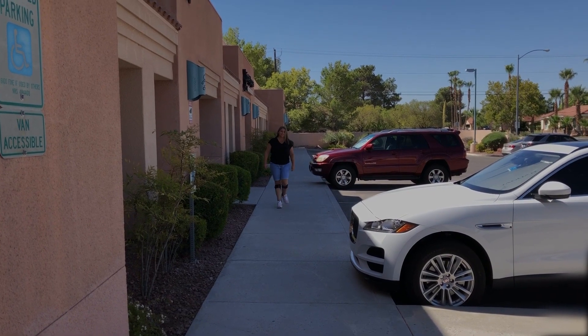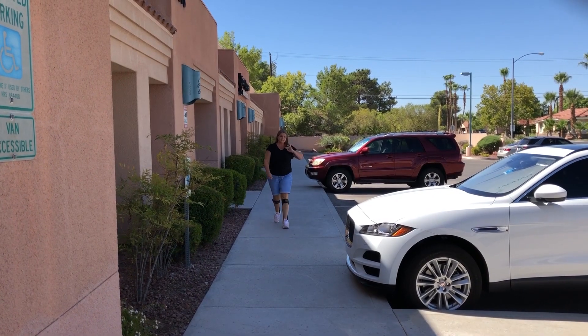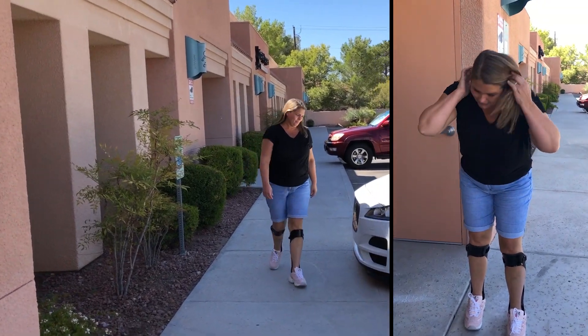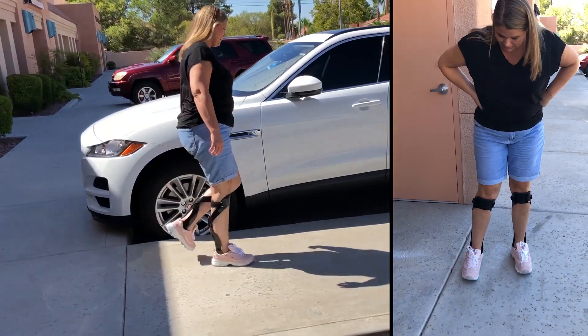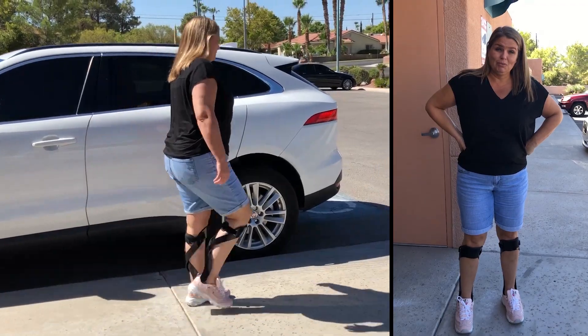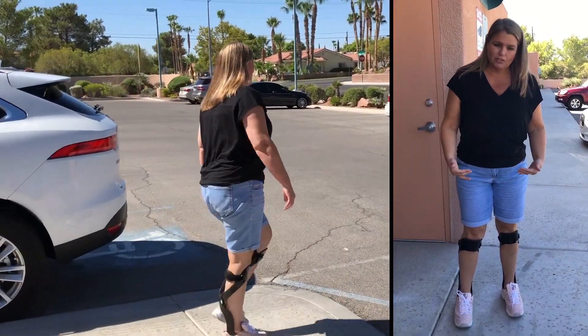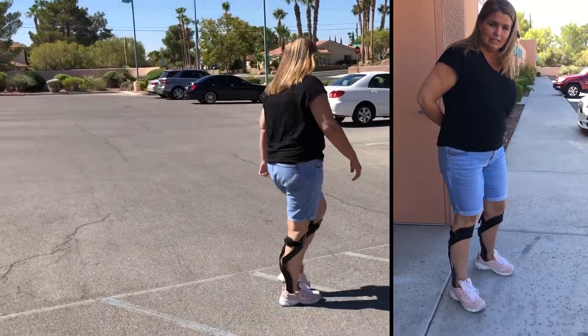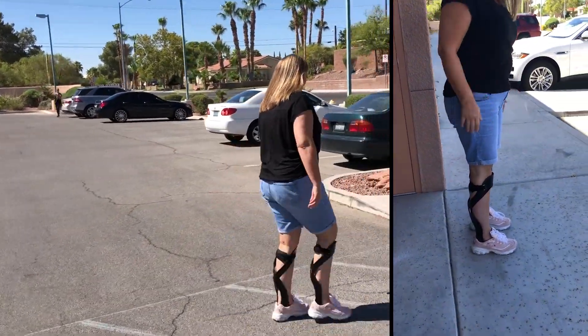Oh my gosh, that's amazing Mitch! I'm in my new Helios braces — my knee is not hyperextended anymore. Mitch did some adjustments on the arch of my feet, which feel amazing. My alignment feels so great.